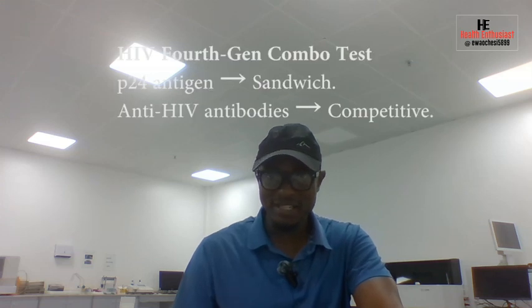So on the same panel, you can have two lines appearing being interpreted as negative and then one line as positive, right? Now let's talk about the HIV fourth generation combo test. Here we talk about the P24 antigen, which is sandwich in nature, and then the antibody to HIV, which is competitive, or indirect ELISA in the lab format.